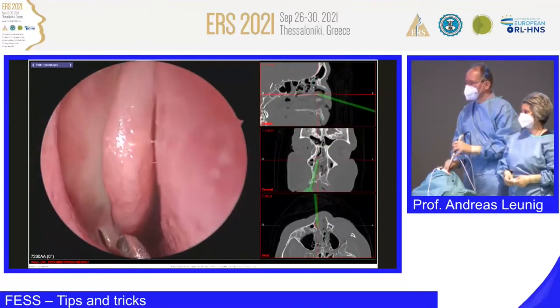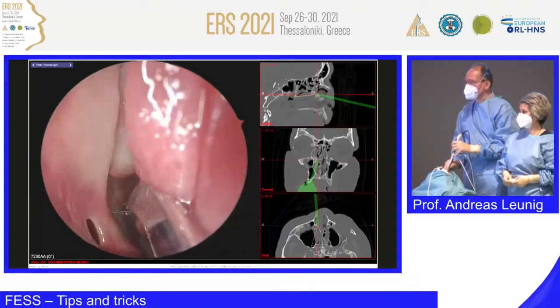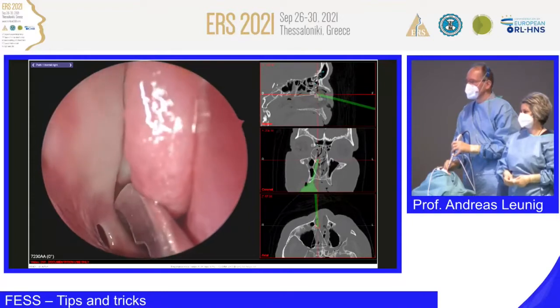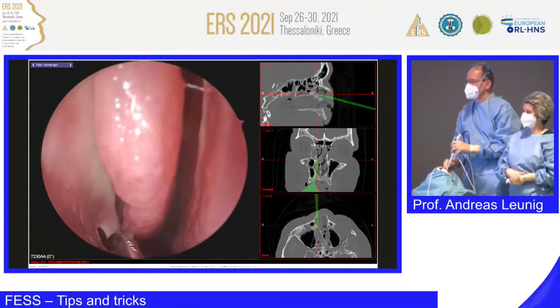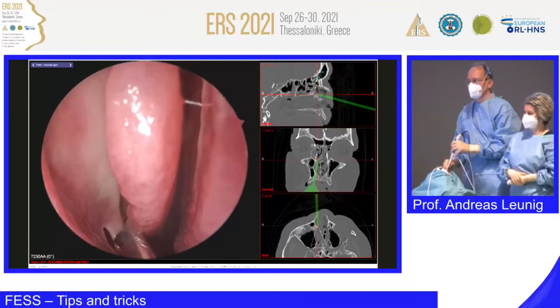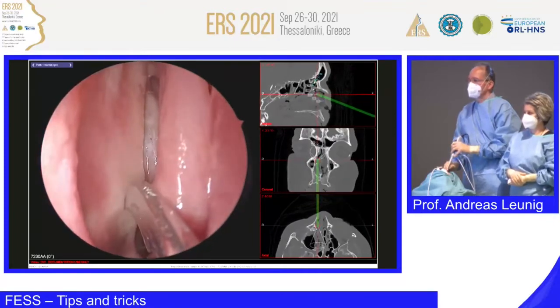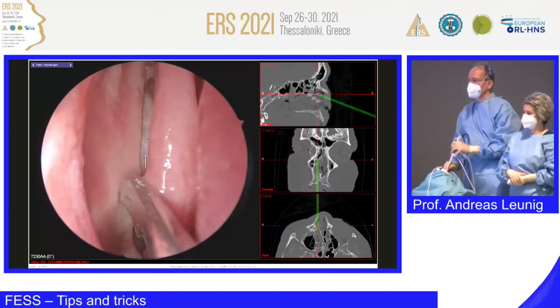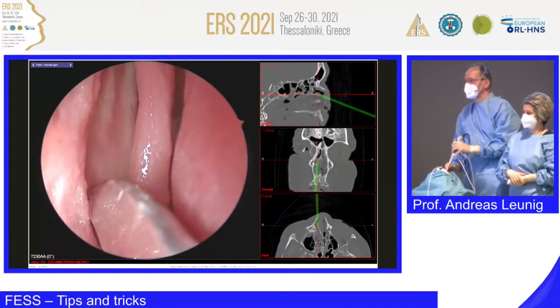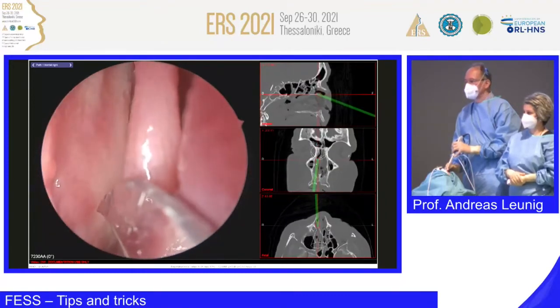You have here a perforation, but now I think maybe, I'm not sure if this is a perforation of the uncinate process or is it the medial wall of the maxillary sinus. Maybe it's too low, and that's because it's a perforation of the medial wall of the maxillary sinus. Now, when you resect the uncinate process, you look for the attachment of the uncinate process, and usually it's here. It's the so-called maxillary line.